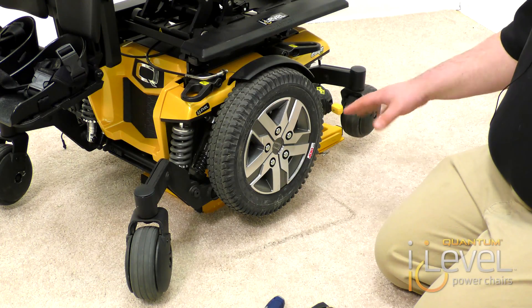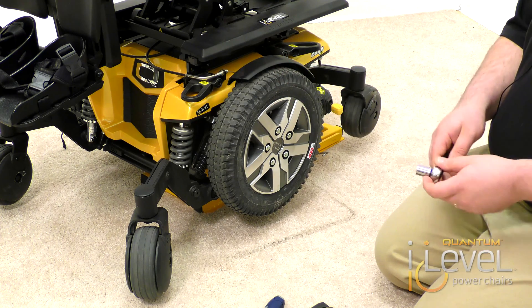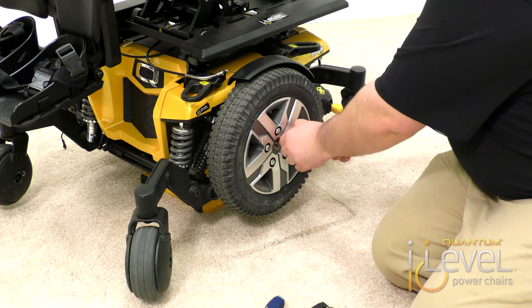The first step is you want to make sure your chair is elevated so the drive wheels are actually off the ground. Take a 13mm socket and you're going to remove the drive wheels.